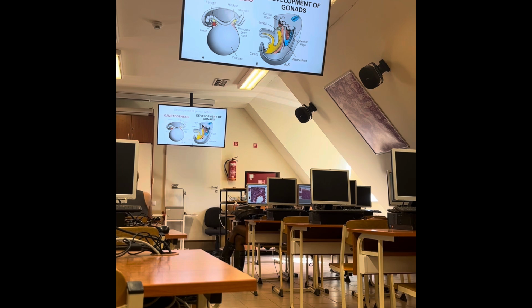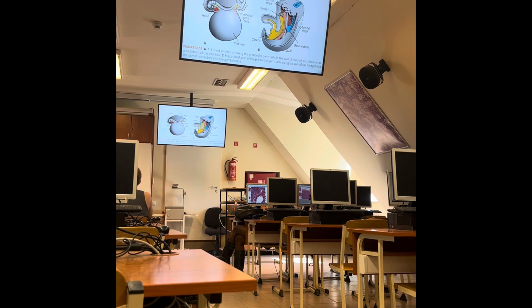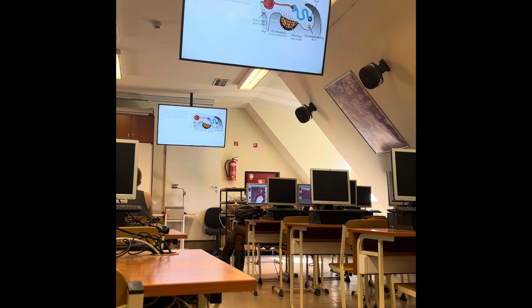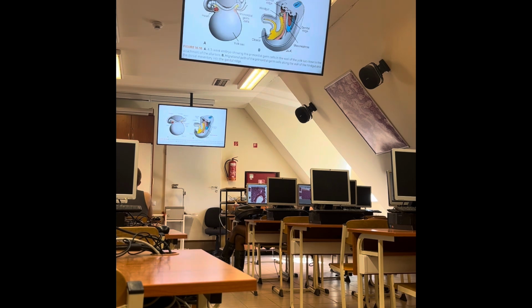This is the so-called genital ridge. This is the image I wanted to show to you, where it shows the location of this genital ridge.